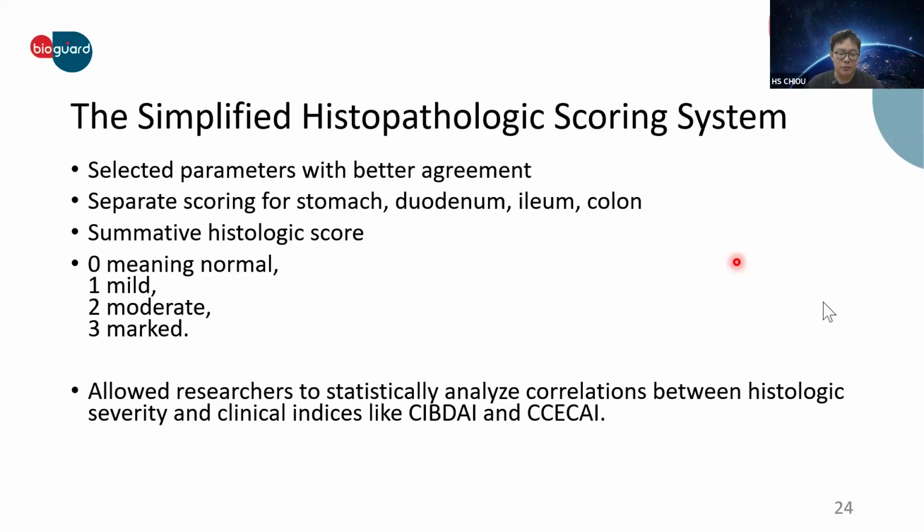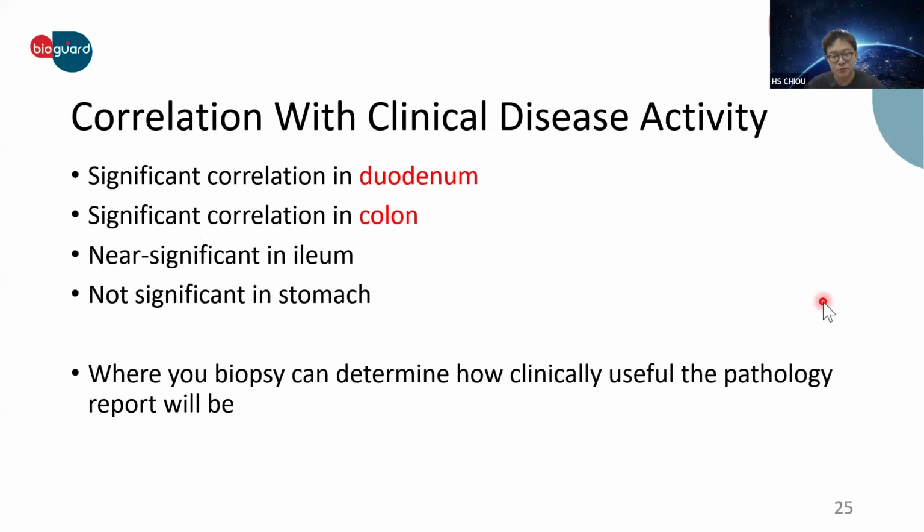And here's the key point. By simplifying the system, reproducibility improved. And once reproducibility improved, meaningful clinical correlation began to appear.